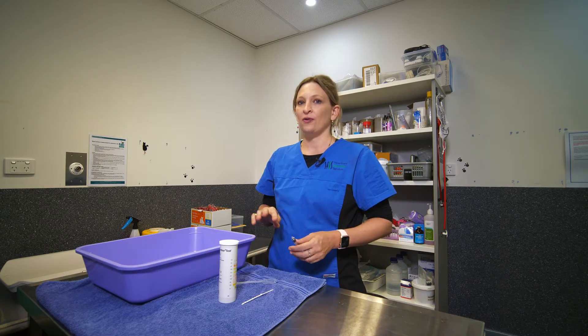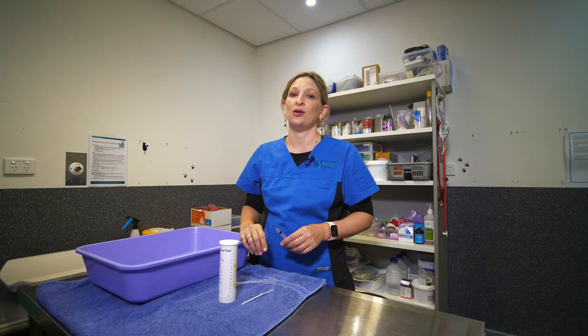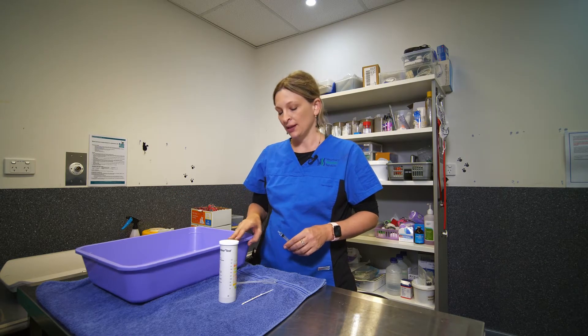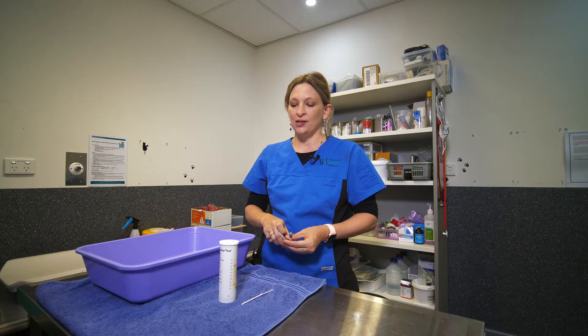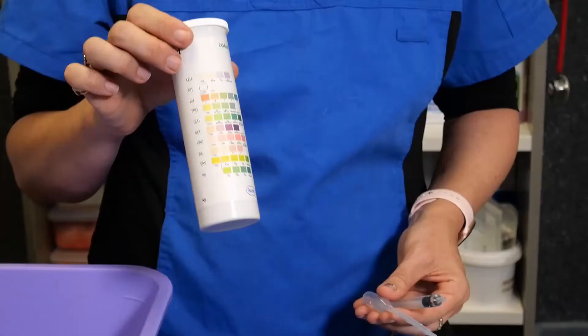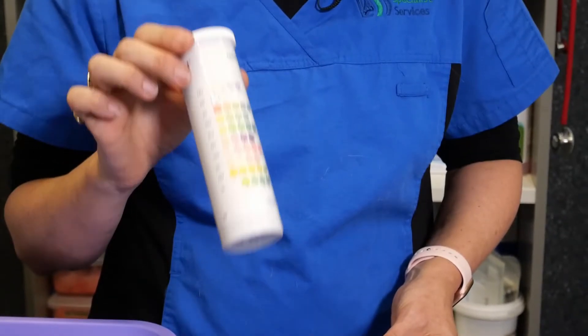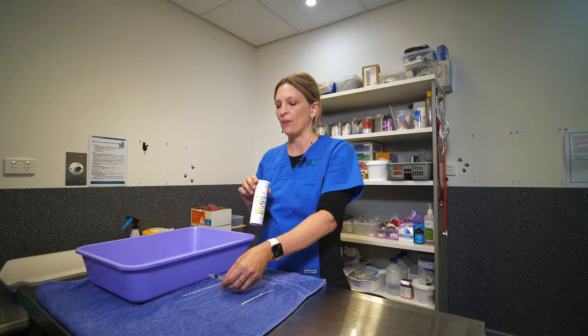So once you've obtained the urine sample from your cat, ideally using the non-absorbable litter beads, we will then ask you to perform a urine dipstick. These test strips will be obtained from a pharmacy and we can give you details of where to get these from.